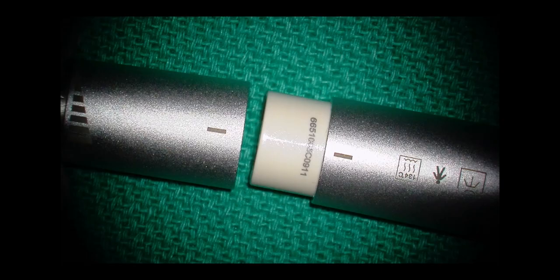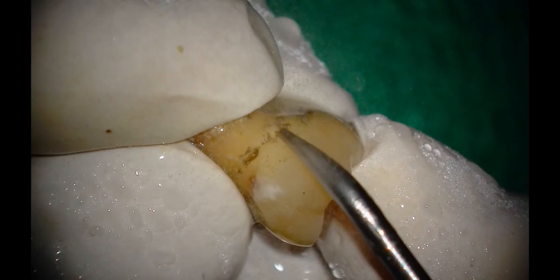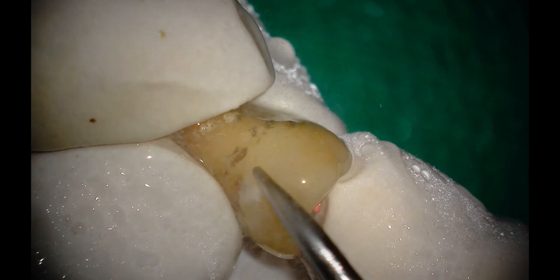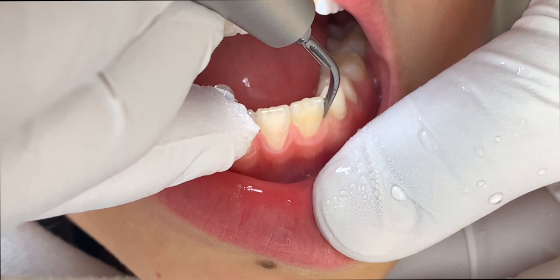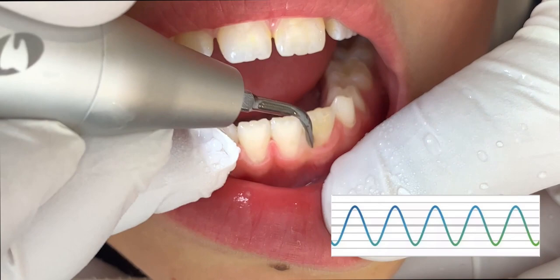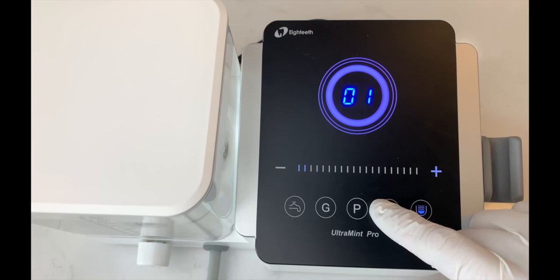Once you have the unit set up, all you need to do is align the indicators on the coupler and the handpiece, slide them together, and you're ready to change lives. The artificial intelligence automatically adjusts its frequency based on the surface conditions. All you have to do is adjust the smart touch control system for the procedure you're about to perform, and that's it. The sine wave drive will ensure a comfortable scaling experience for your patient, and the elliptical stroke pattern provides a beautiful polishing effect.